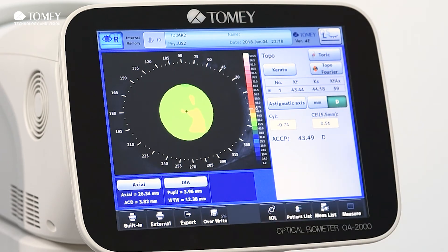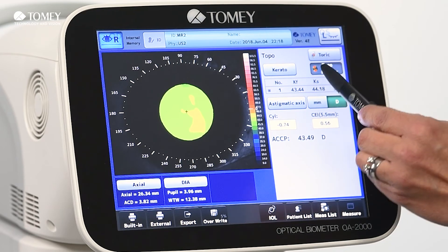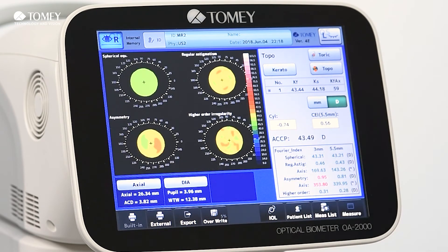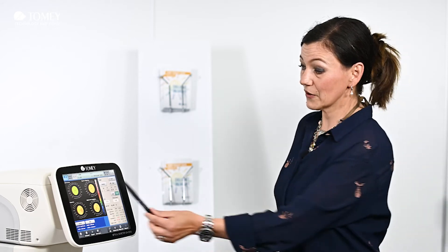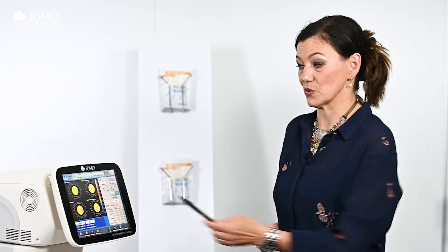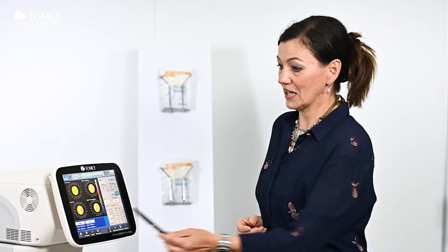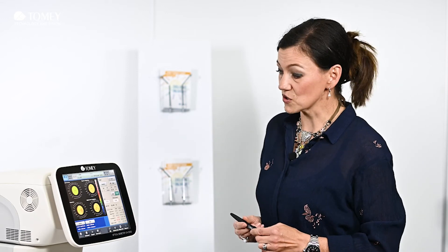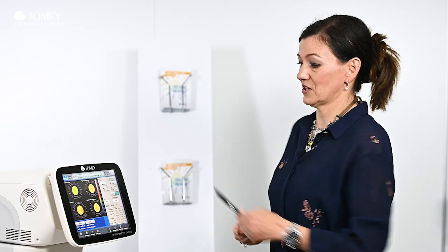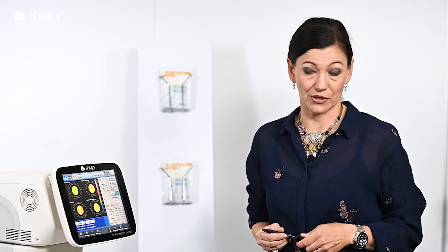We also split up the topography into three different segments — this is the Fourier analysis. This gives you additional information right away with just one click. Here we divide the cornea into regular astigmatism, asymmetry, and higher irregularity, so with one simple view you can see if this is a completely irregular cornea or not.